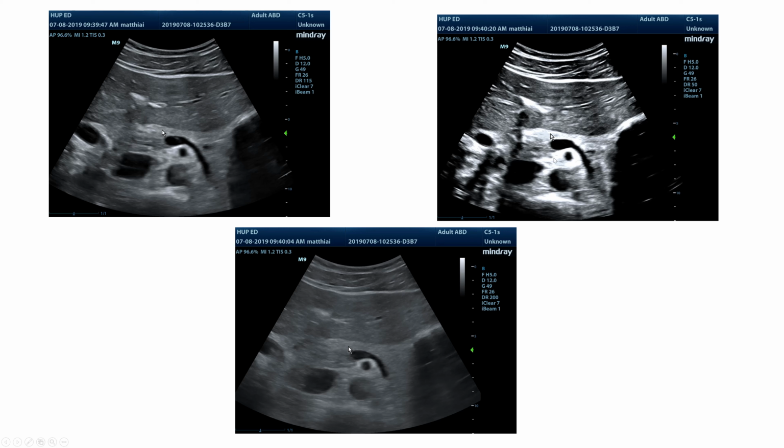And now this fat that surrounds the SMA is just completely white. It's a grayscale value of 256, totally echoic. Compare that to the higher dynamic range curve, where it's more echoic than the things around it, but it still has some gray to it.